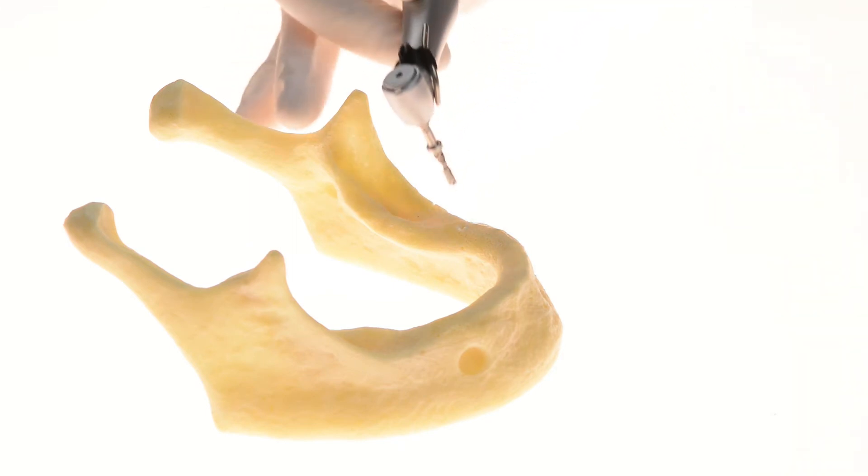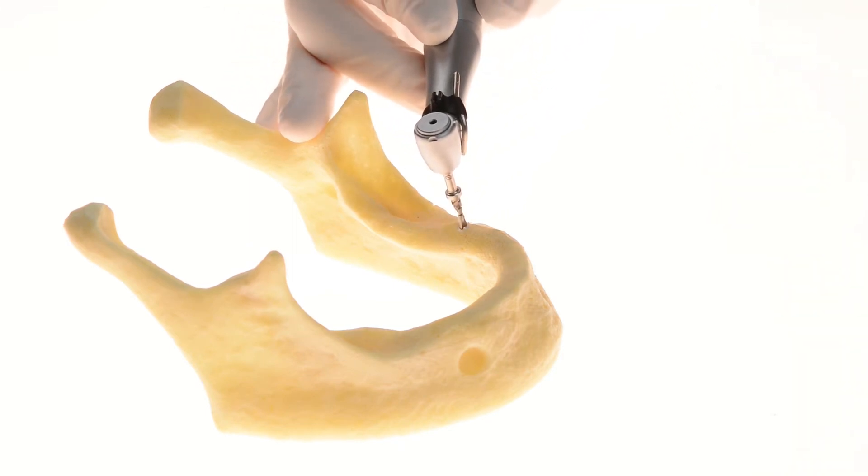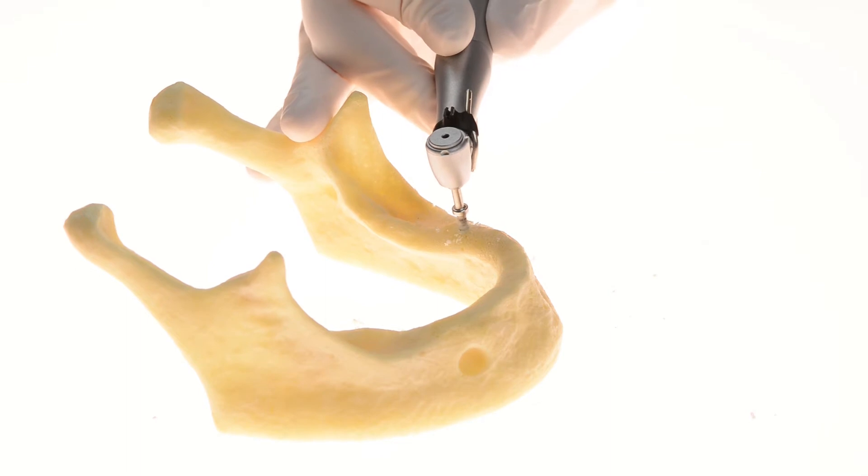The pilot drill includes a built-in stopper where the drill tip is 2mm in diameter, while the rest of the drill is 2.4. This step ensures a more stable start to the procedure. The pilot drill goes to the full depth of the osteotomy.